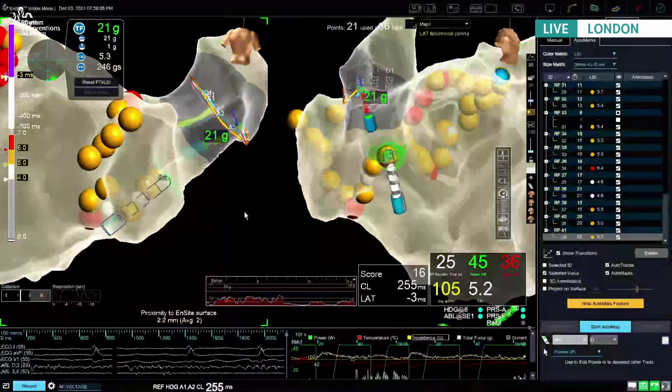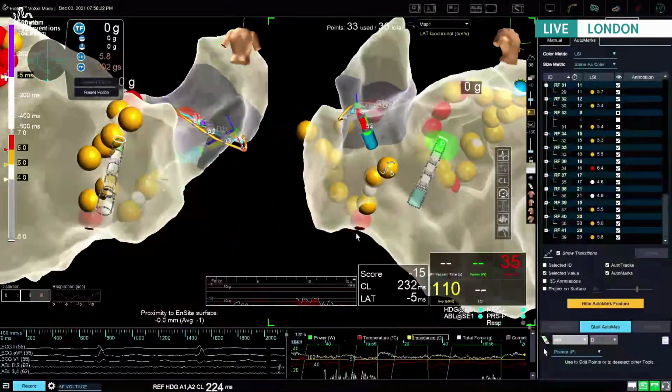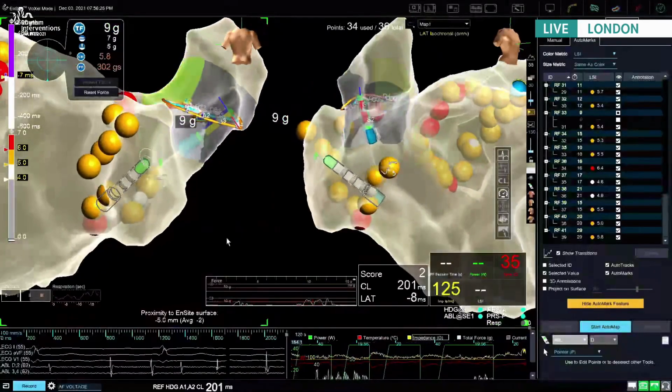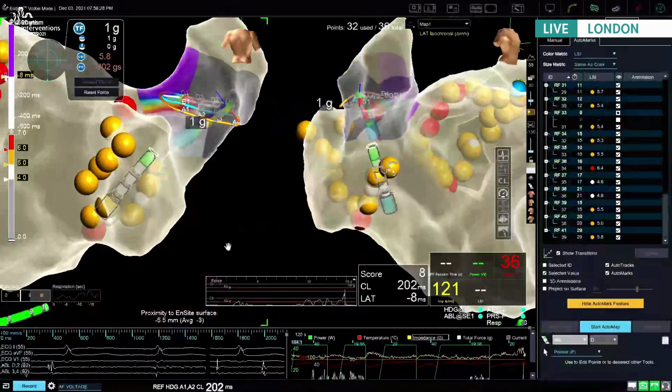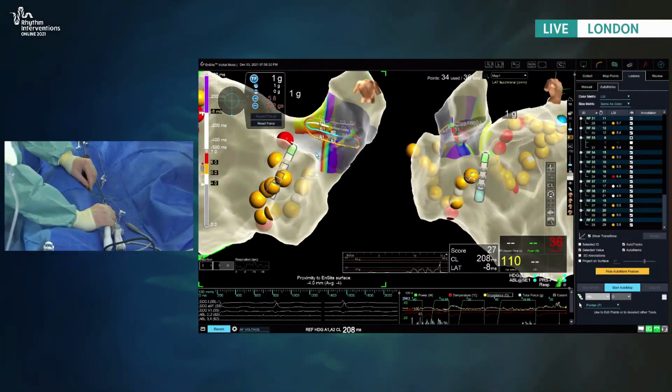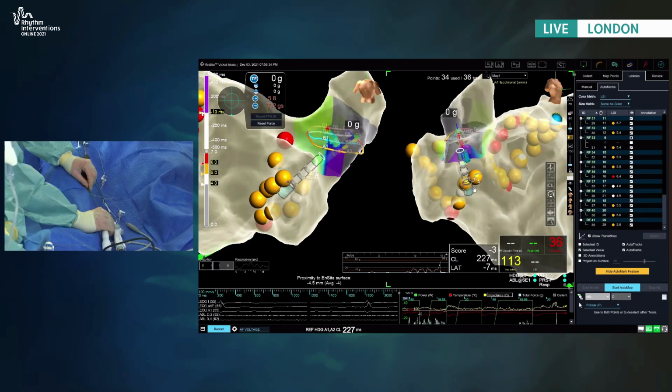Can I ask you a question? Given that we're just isolating the pulmonary vein, what's your view about using cryoablation in these cases for persistent AF? Cryoablation is very good. We use an awful lot of it, and I've got nothing against cryoablation. I think it's a little bit horses for courses, and there are some patients, particularly paroxysmal AF, that we expect to do nothing else for.